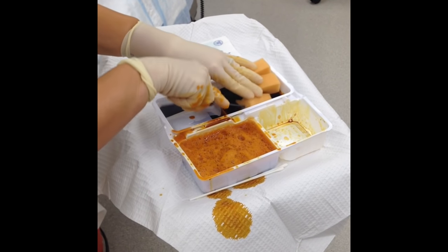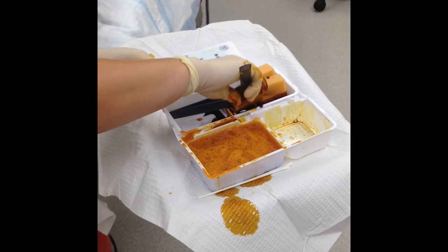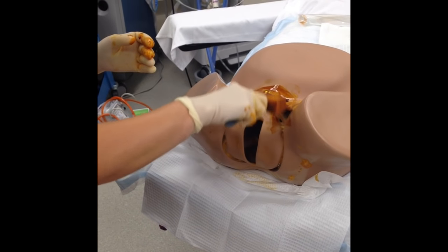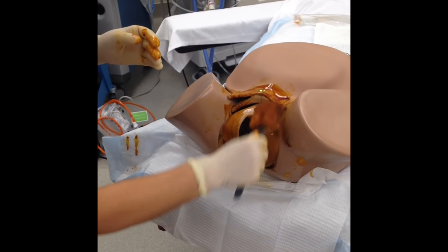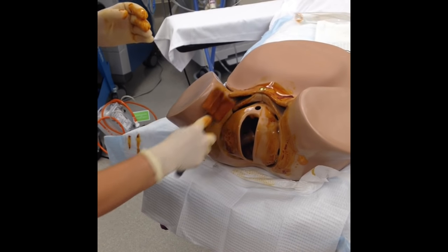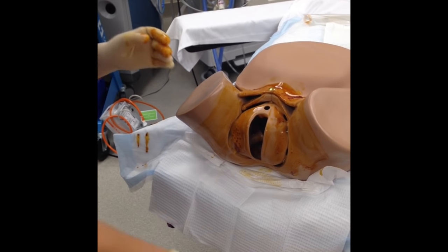Now we're going to go ahead and use our paint. The paint portion is after the scrub — we're going to do the external first, following the same contours. Paint is just that — there's no scrubbing involved, you're just painting like you're painting a house. Once it's brown, you're done. I'm going to work from in to out, and I'm also going to do one final swipe down here on the anus.